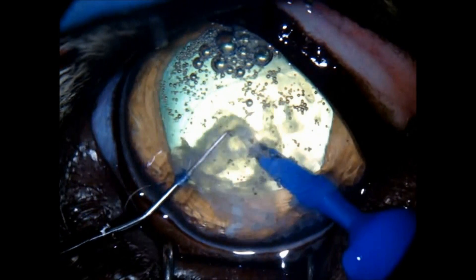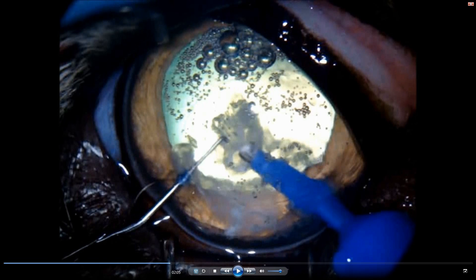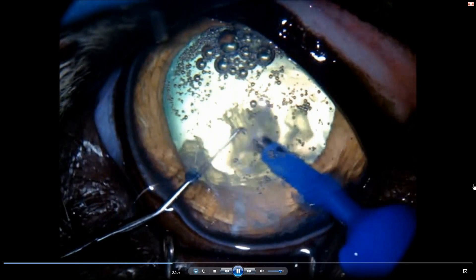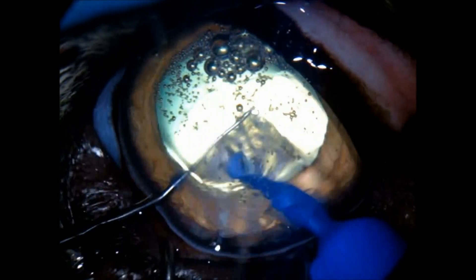It takes a long time to aspirate everything. The central part of the nucleus is very hard, so we have to use both hands doing the stop-and-chop technique in order to fragment this hard part. It takes a long time because the central part is very, very hard — quite a unique feature in this species. Ultrasound power should be 60% to 65%.